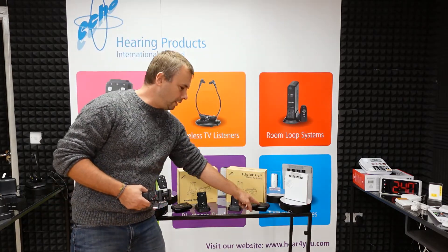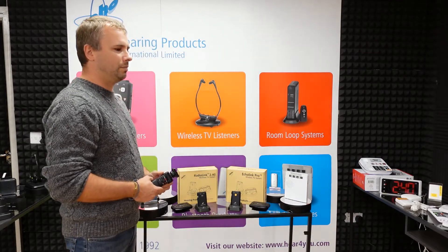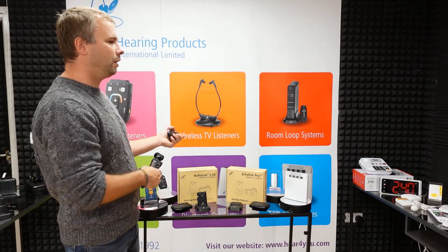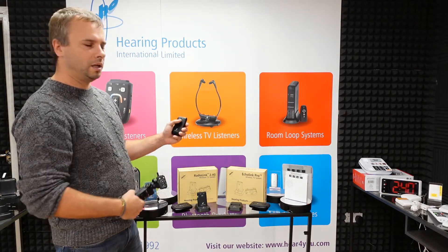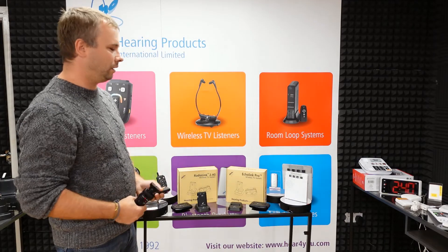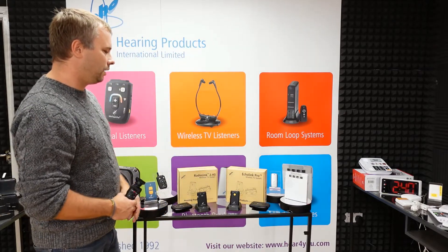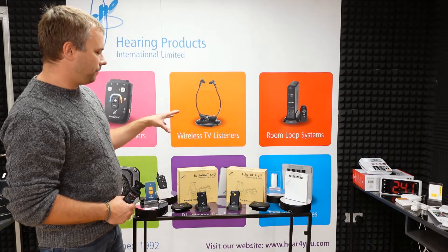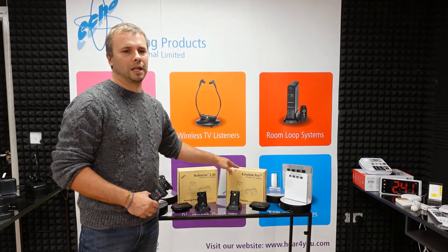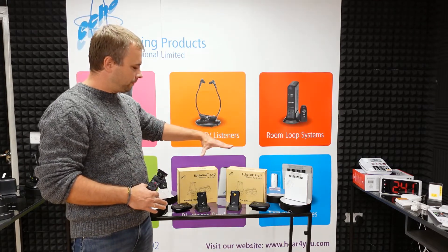Echolink Pro uses an infrared signal, which means the transmitter must see the receiver — you have to keep a line of sight between the two units. If you cover the receiver, put it in your pocket, or go to another room, the signal will be interrupted. With RadioLink 2.4G the signal goes through walls, up to around 20 to 30 meters. That's the main difference in transmission. Because of this, Echolink is slightly cheaper than RadioLink 2.4G as the infrared technology costs less, though the sound quality is really great in both.